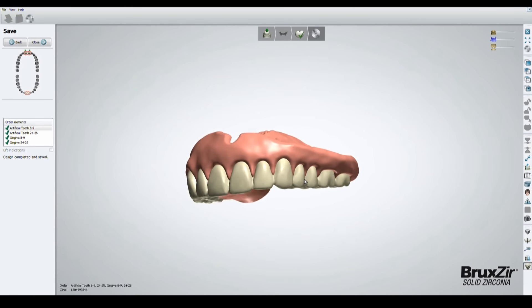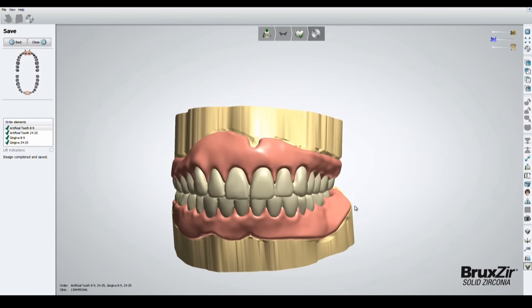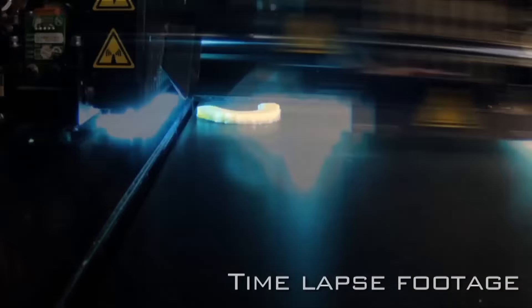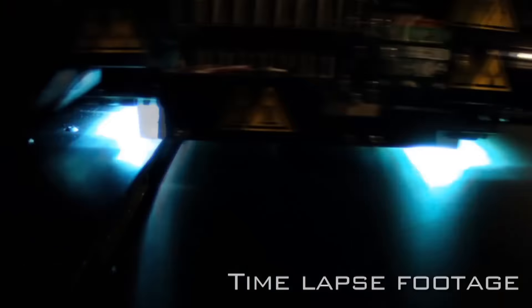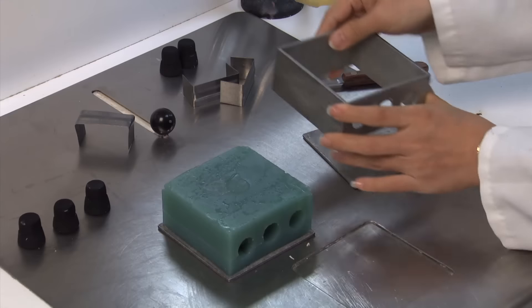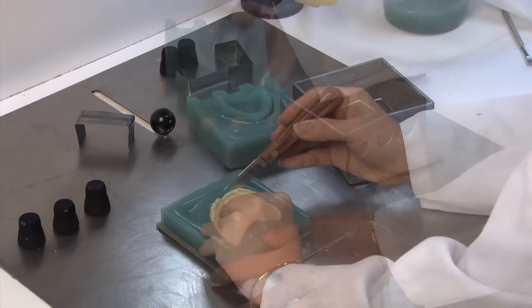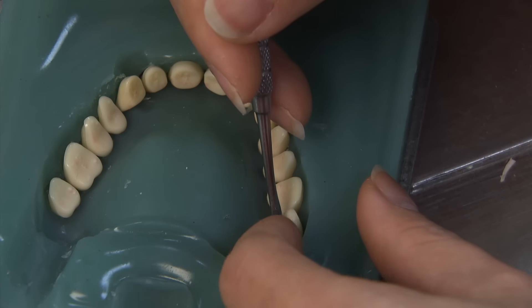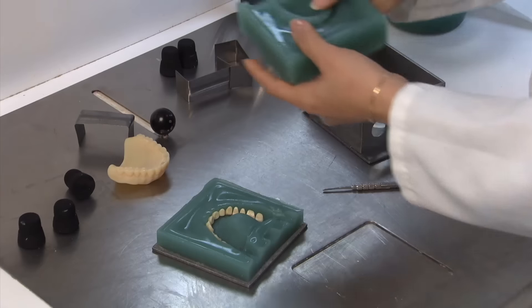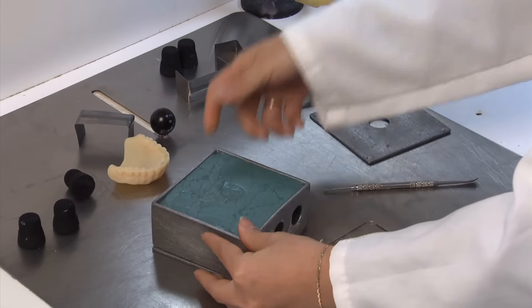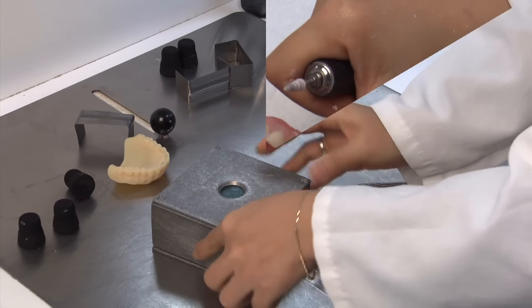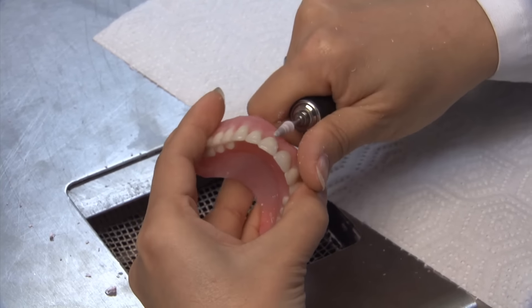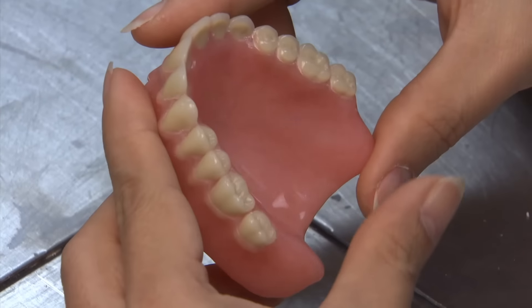At this point we have a digital file we can utilize for fabrication of the final denture. We print the edentulous arch — both arches — and also print the denture itself, so the denture can be processed based on the edentulous arch. We go through the processing of the denture: once we have the negative of the denture and the duplicate is removed from the mold, we place the acrylic and proceed with processing. An alternate method is to have the denture milled with acrylic material — if you want to go completely digital with no analog work, the entire denture can be milled. Here we have a nice final product.